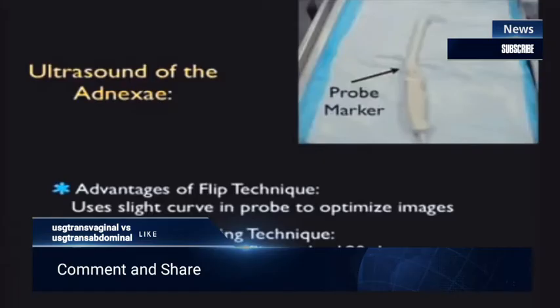So I think it's important for you to try both of these techniques and figure out which works better for you. There are some advantages of the individual techniques. The advantage of the flip technique is that it uses a slight curve in the endocavitary probe and aims it out towards the appropriate adnexal area to optimize the images on the ultrasound screen. The advantage of the swing technique is that there's no need to flip the probe 180 degrees while moving between the right versus left adnexal structures and visualizing the ovaries.